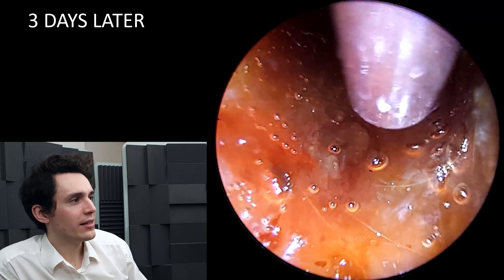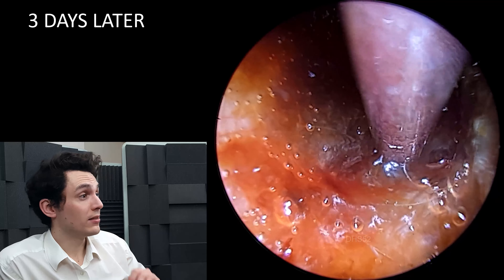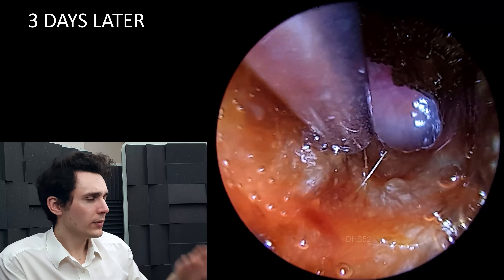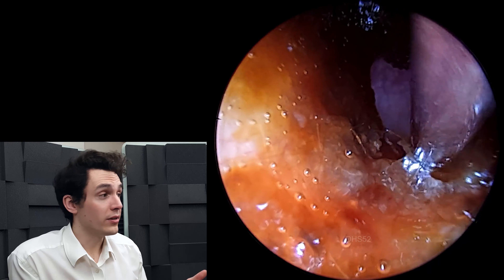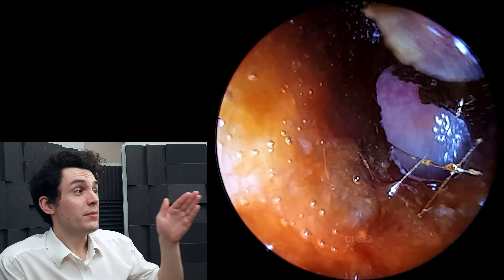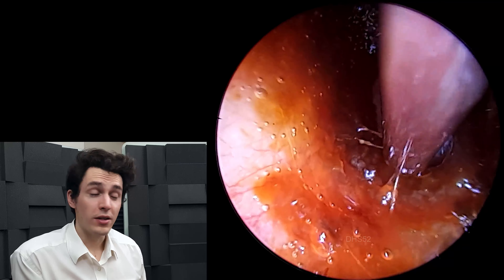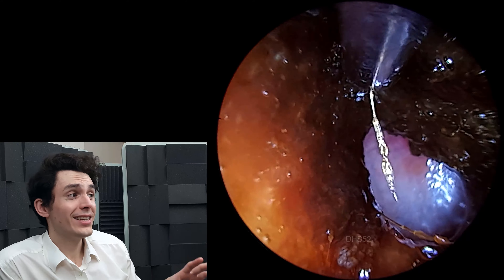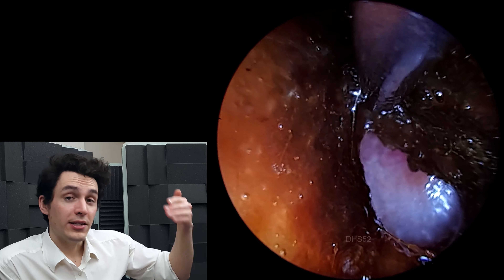And you can see all the bubbles here that are formed. According to the patient, they had used just a huge amount of olive oil, which is what I wanted. They came to the clinic feeling like the hearing was actually pretty good, and I'm not surprised because the olive oil has done most of the work for us. Looking at this, it's pretty good — there isn't necessarily a problem per se, because the eardrum is back there and it's intact.